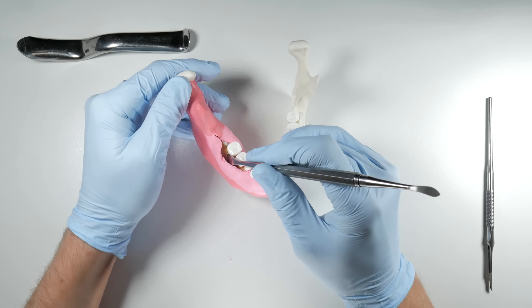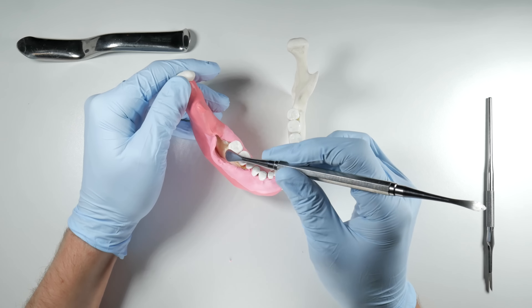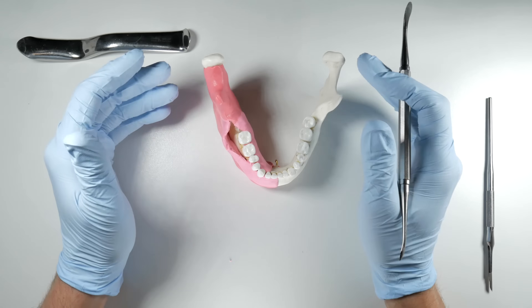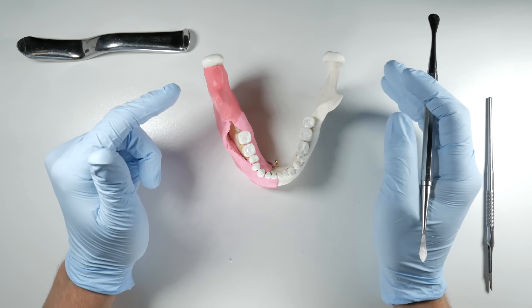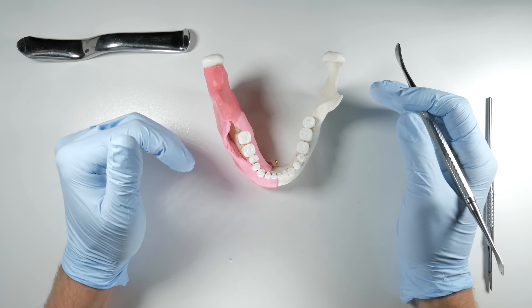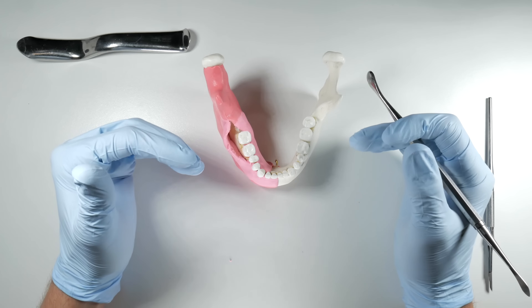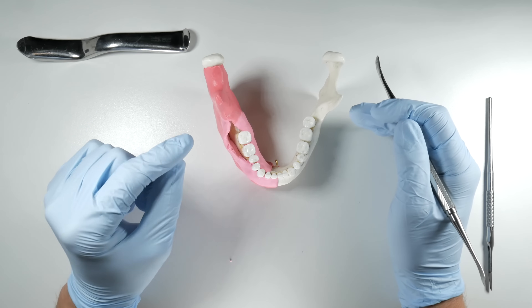As you push distally and slide along the bone, the tissue is going to fall open, giving you a nice area where you can place a retractor to control the tissues. In the mouth it will take you some time initially, and that's okay — don't worry about getting to the next step. You want to do every step really well. The flap is key, because if you're working with a poorly designed or poorly reflected flap, it's going to really hinder you when trying to get the tooth out.